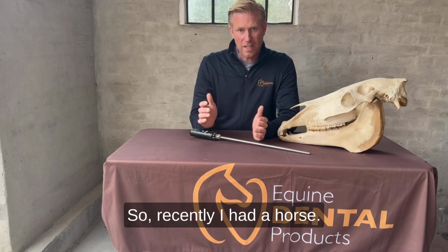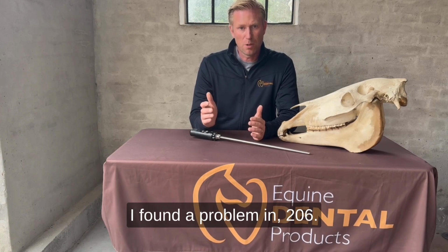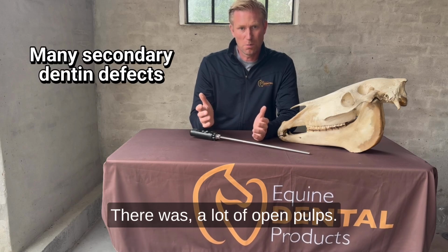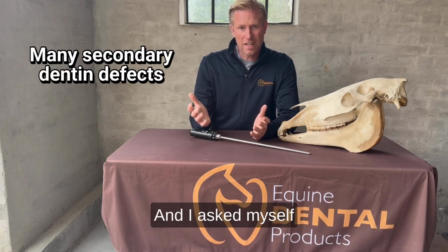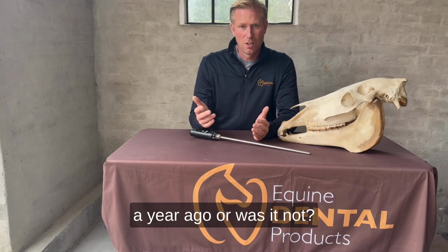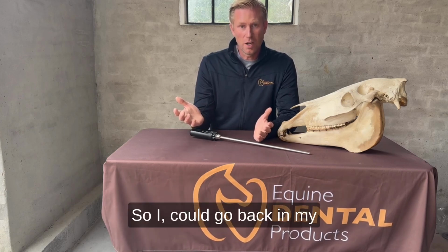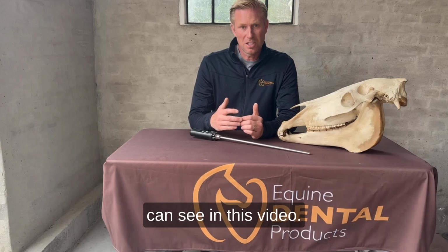So recently I had a horse and when I did the examination I found a problem in 206. There was a lot of open pulps, and I asked myself the question, was this present when I saw this horse half a year ago, or was it not? And of course the owner asked the same question. So I could go back in my journal and have a look, and that is what you can see in this video.